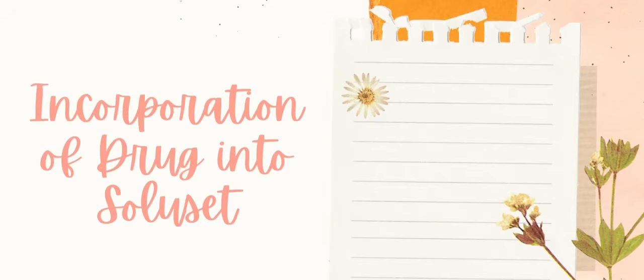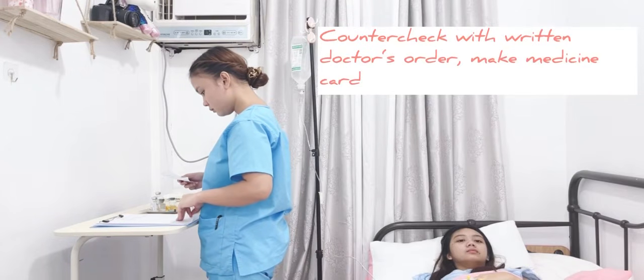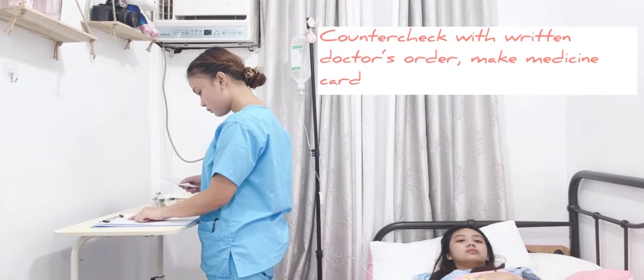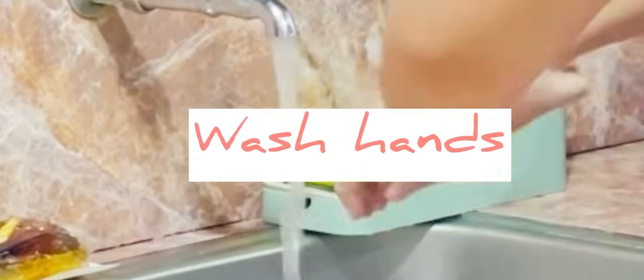Next one is incorporation of drug into Soluset. First is to counter-check with written doctor's order and make medication card. Client's overall physical condition and compatibilities of ordered medication dictate type of IV solutions used to ensure safe and accurate drug administration. Then wash hands to reduce transmission of microorganisms.